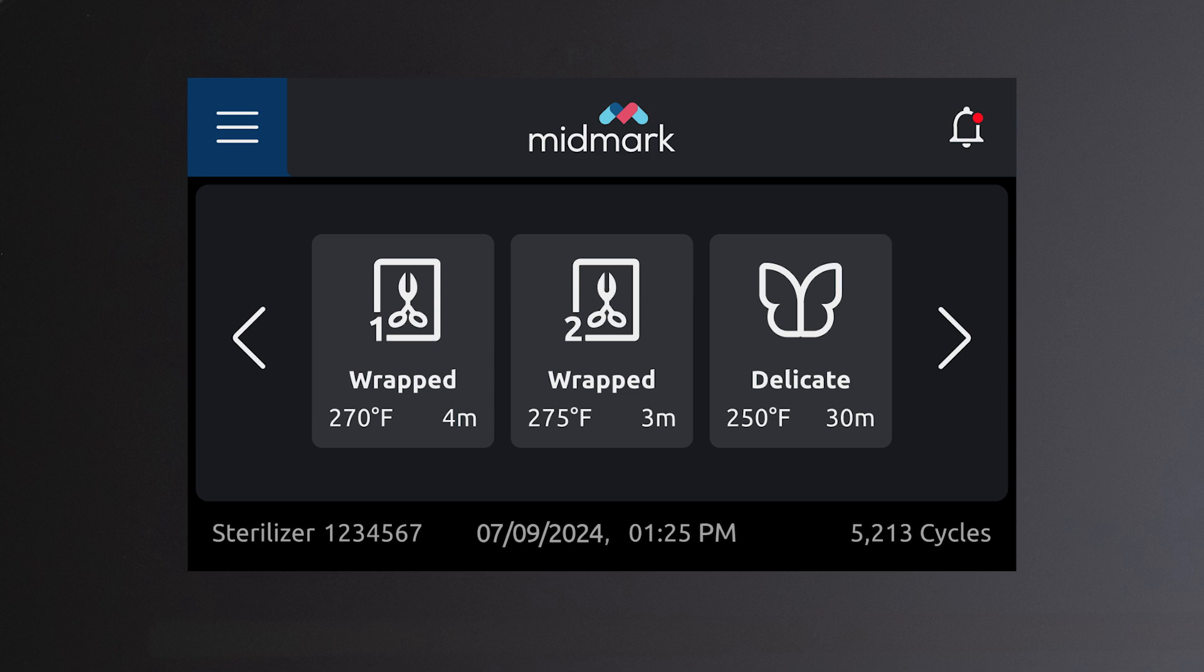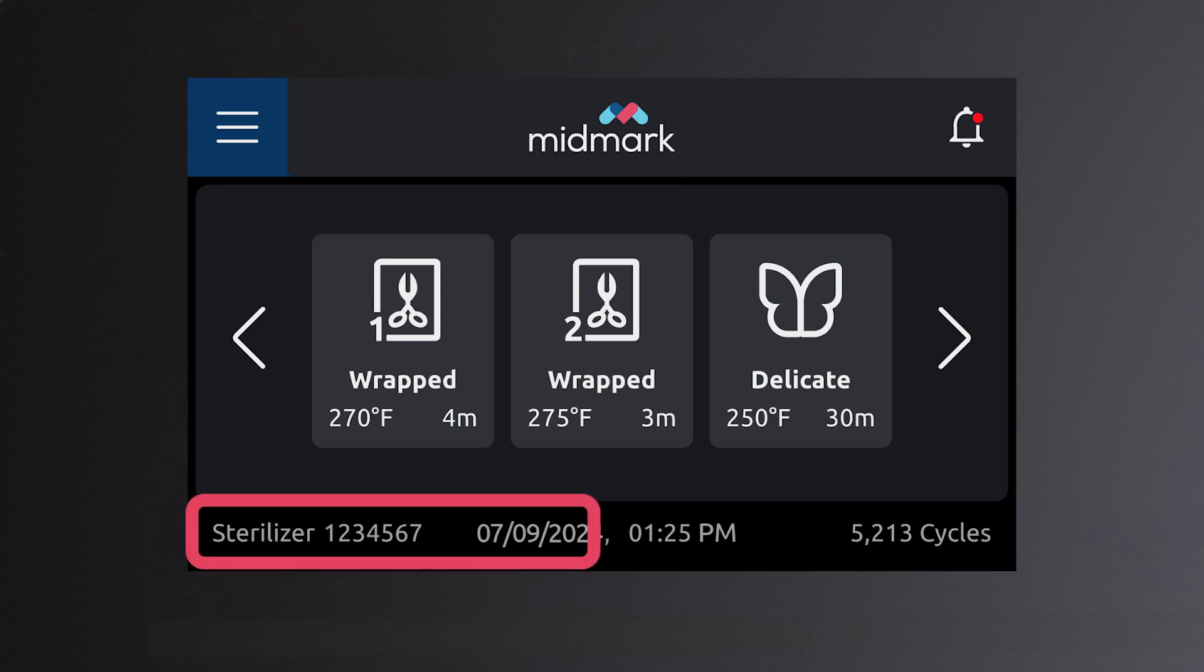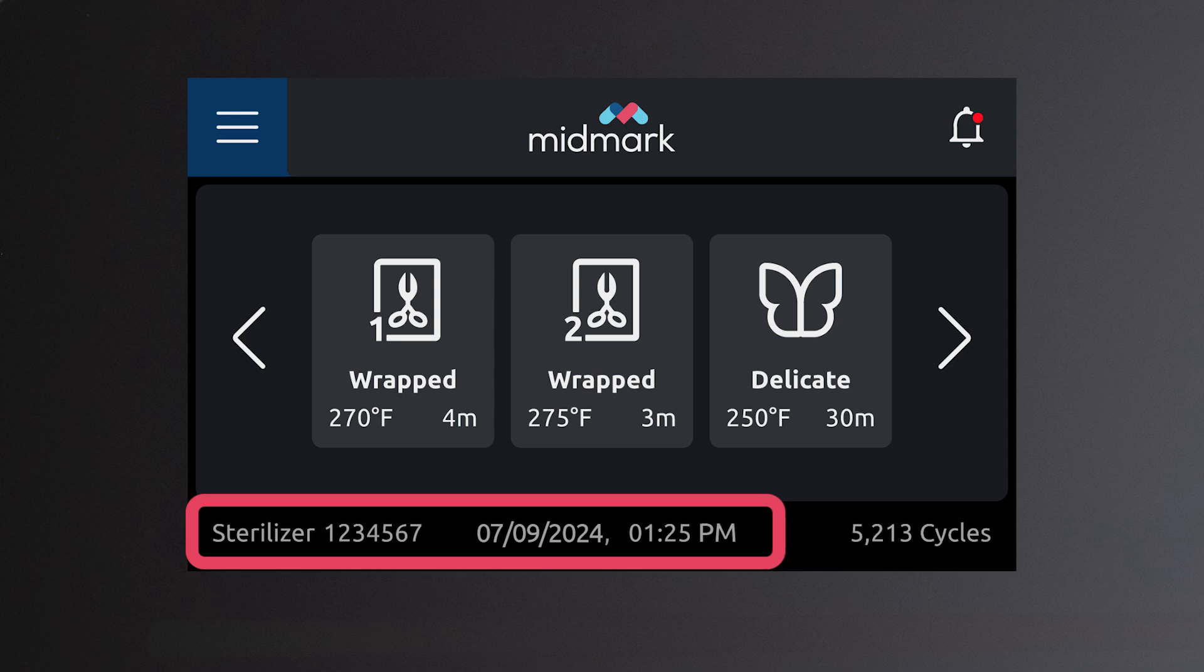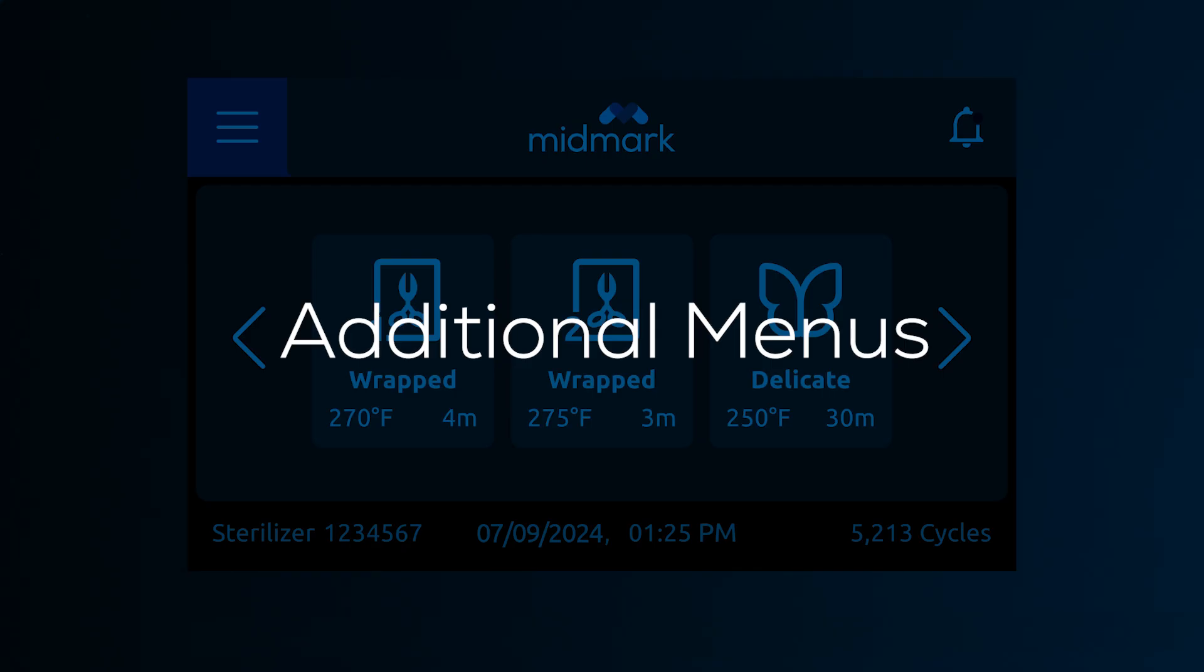The cycle option icons allow you to select the appropriate cycle for the load you are processing. The sterilizer name, as well as the date, time, and number of completed cycles are displayed across the bottom of the screen.